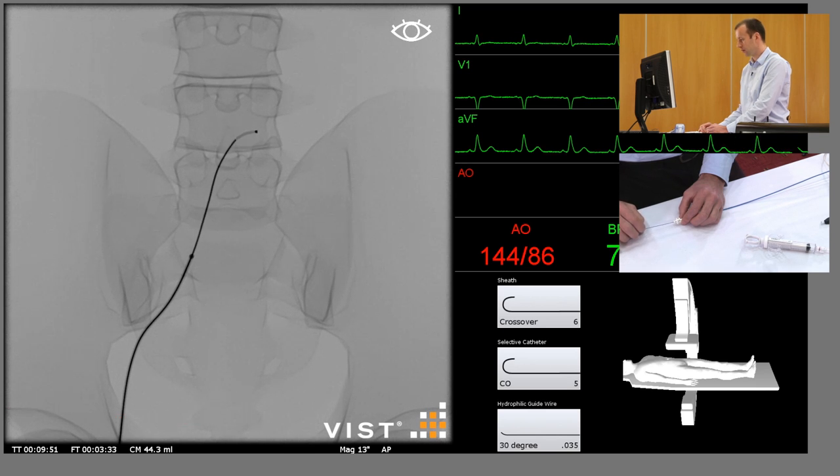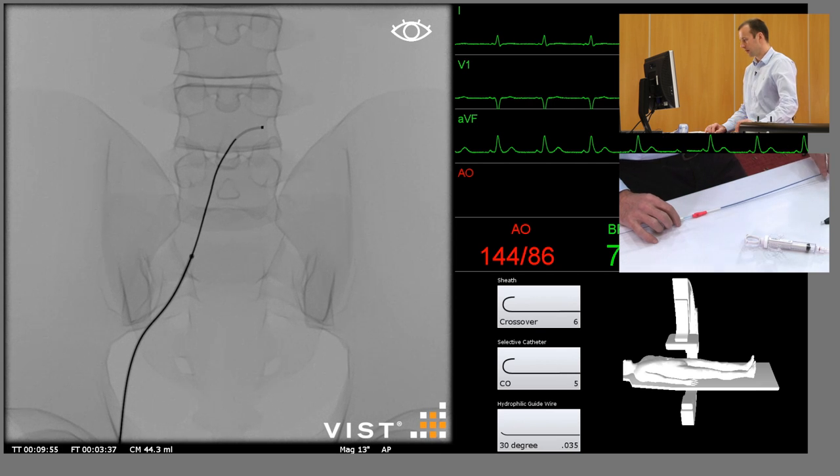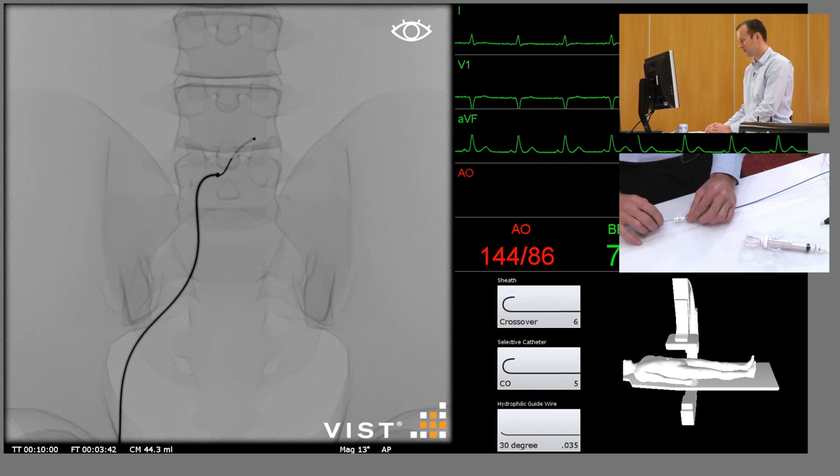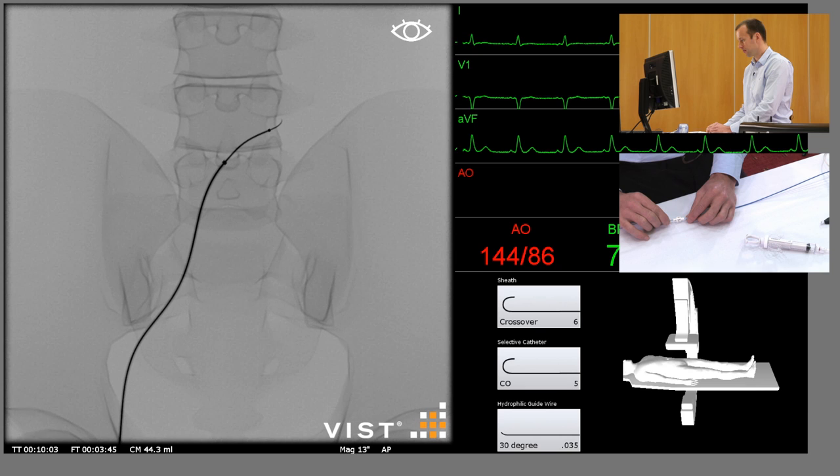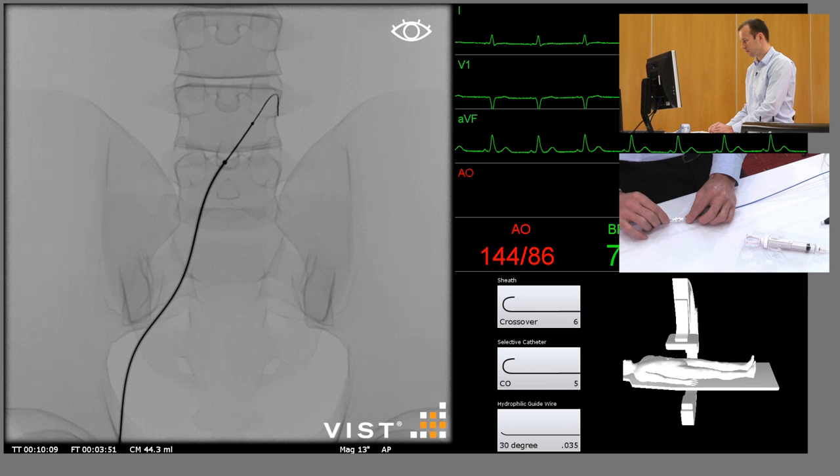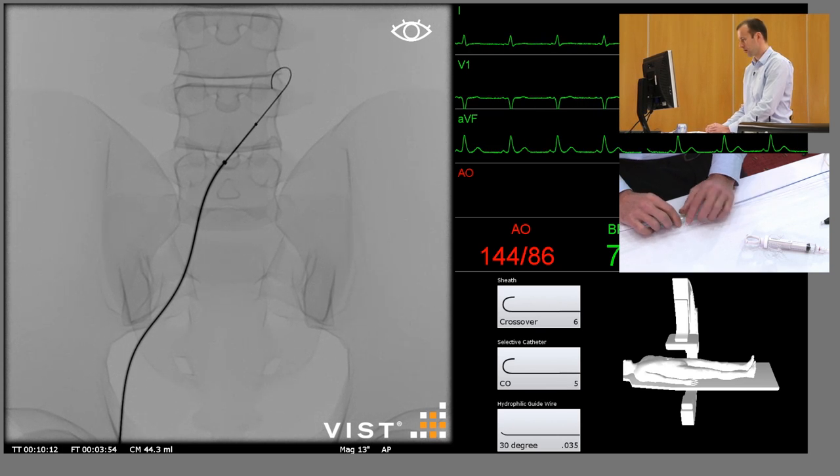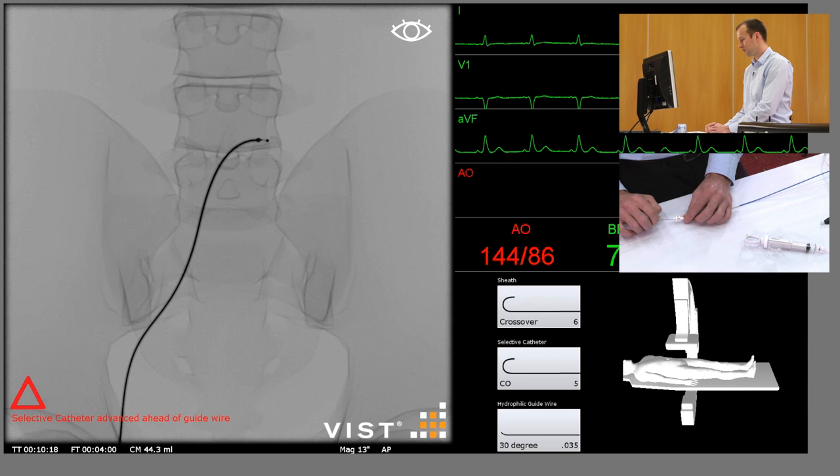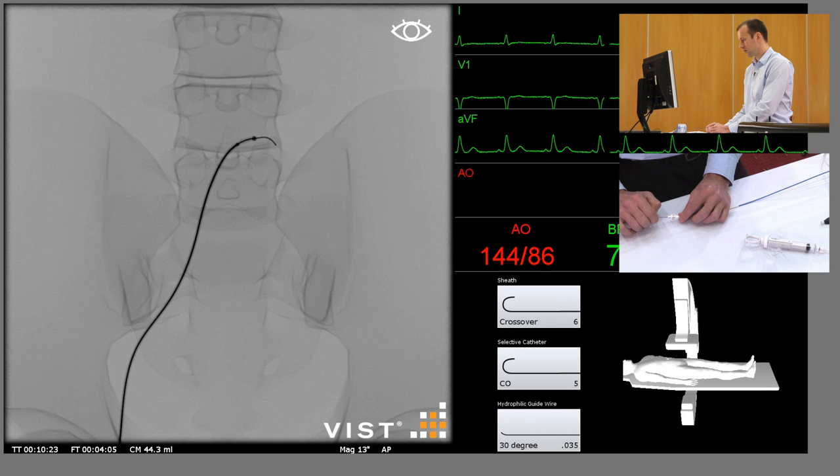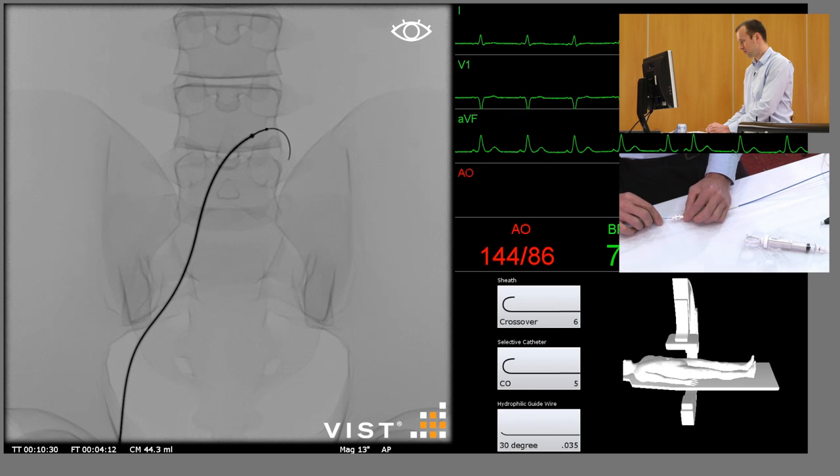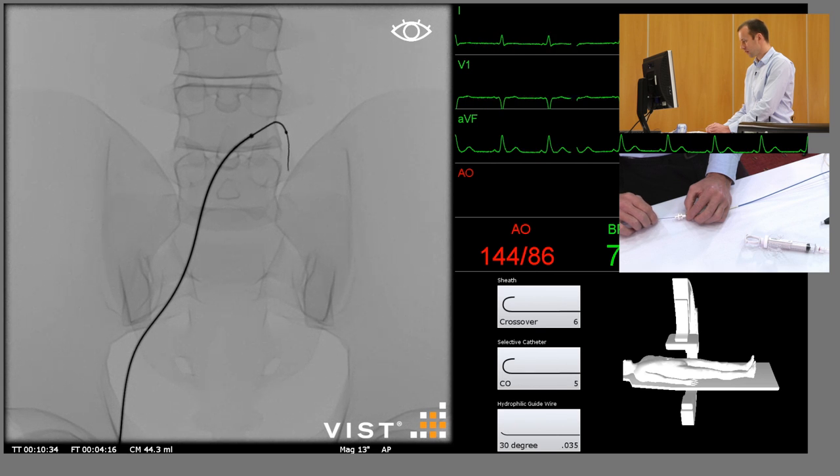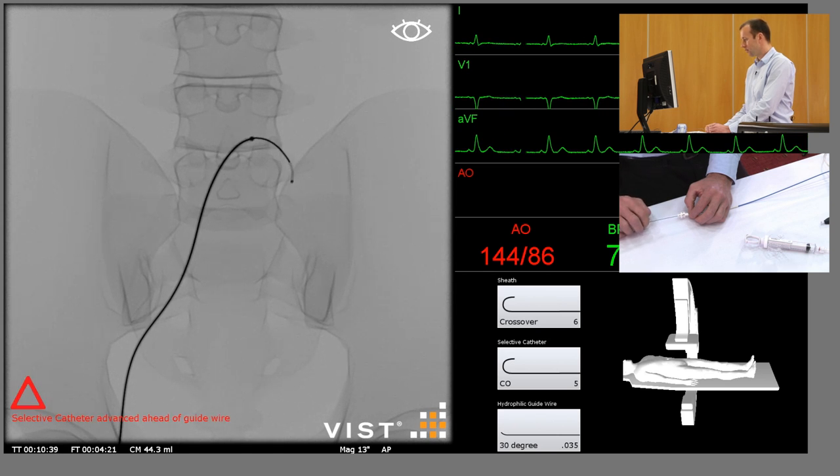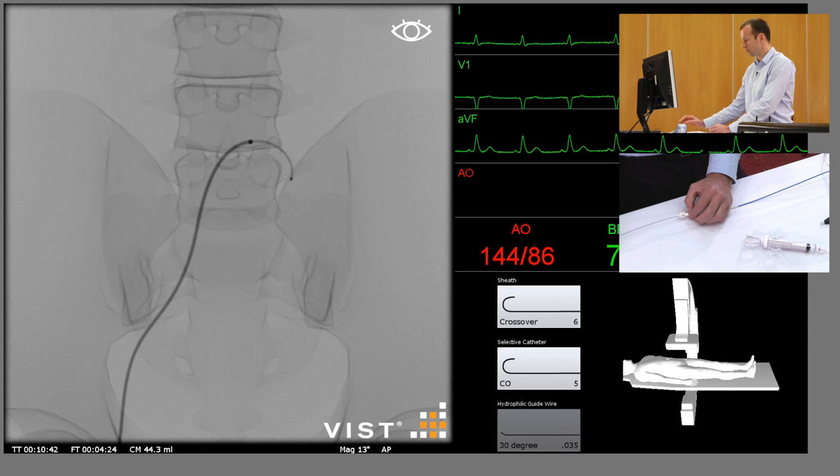Again, give it a little bit more support by advancing the sheath, and this can be done over the guide wire with care. I think we need to take the sheath a little bit further in, and advance the catheter over the bifurcation.